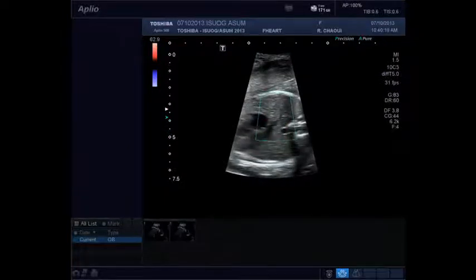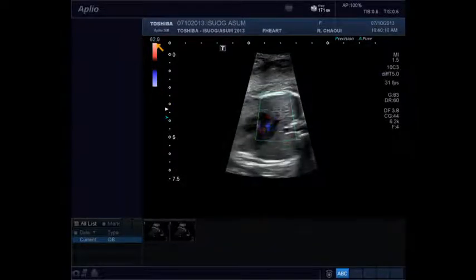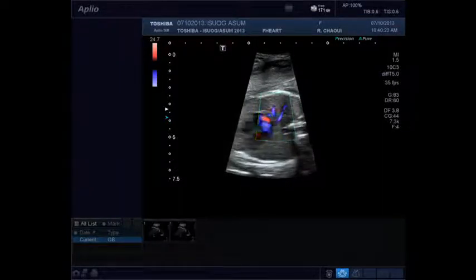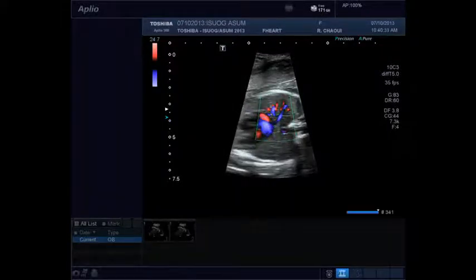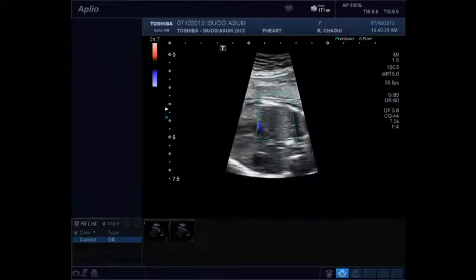And then as you see here on the left side, I hope you can see it, we are at 62 centimeters per second. I will lower the PRF and see what happens now, how nice the veins are coming. You see here both inferior and superior right veins. And this is a very good plane to visualize these veins. I will stop here, and you can see on CineLoop the two on the right. And then I can do the same for the left one.